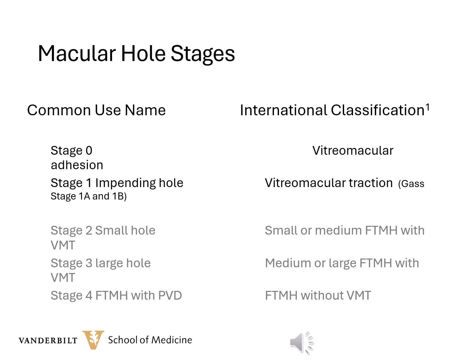This stage is based on the OCT findings where the vitreous is still attached to the fovea, but there is a parafoveal bursa. There is no intraretinal pathology, and this is almost an incidental finding. There may be no clinical findings or perhaps just a decreased foveal reflex.